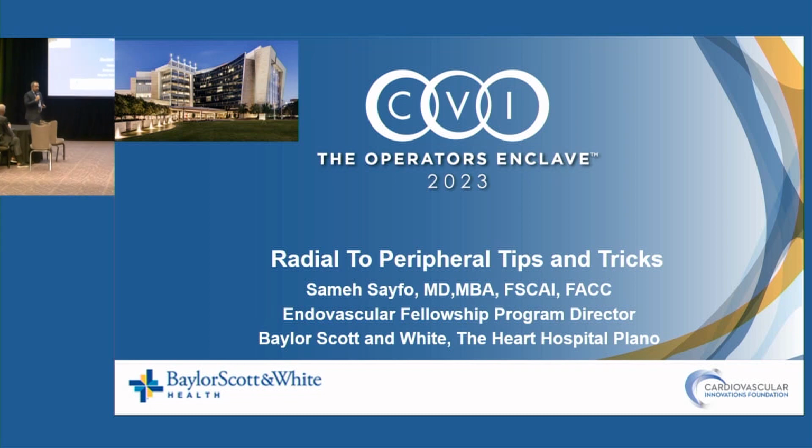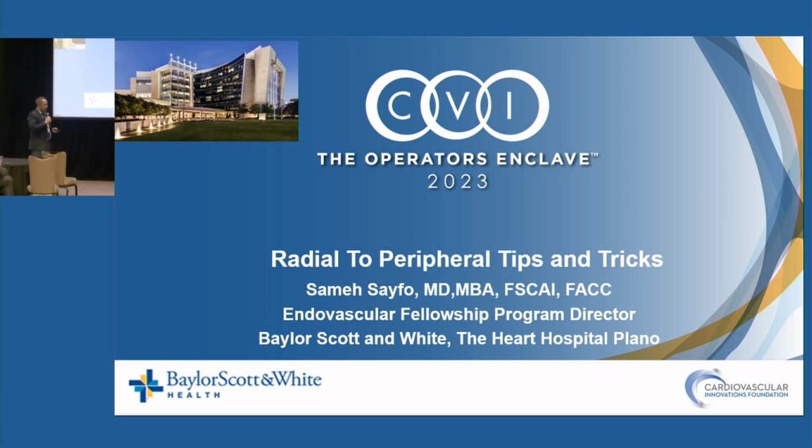So we talked this morning about radial access and options, but in all honesty, if you're doing CLI below the knee, having radial access as your only access is not feasible. I think we still don't have the equipment. We have more and more coming, but what I want to present is a challenging case, and the radial access was helpful in one way.